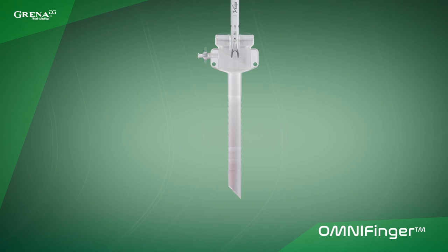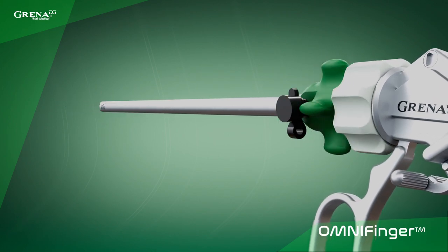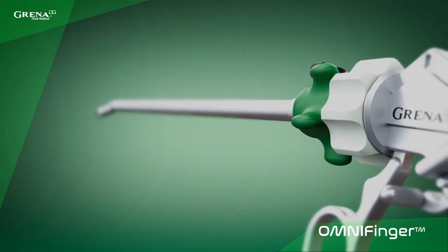The lock works both for jaws and the handle, which secures the clip from dropping from the clip applier. OmniFinger means one finger, and this is everything you need to control the device in all axes.